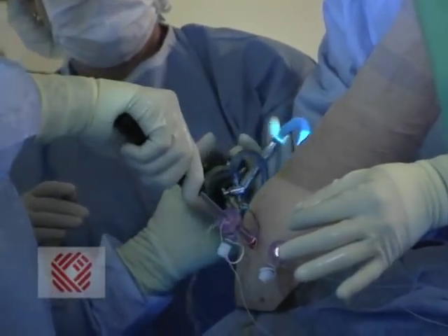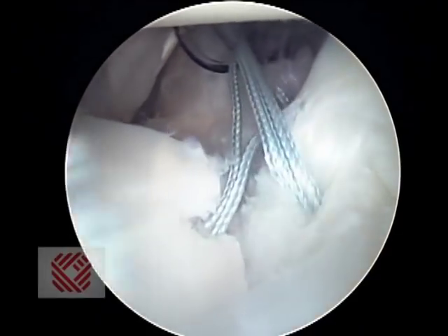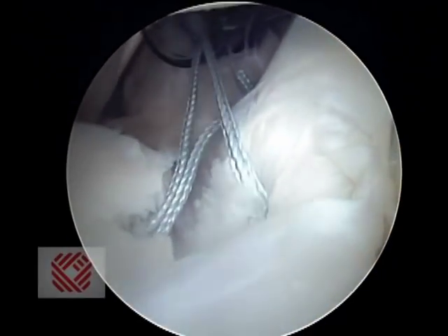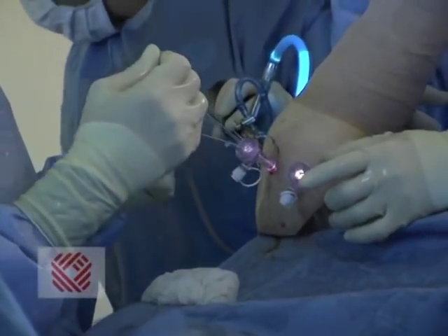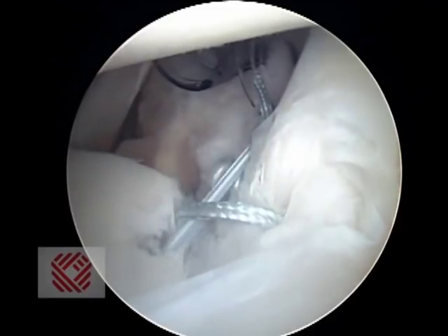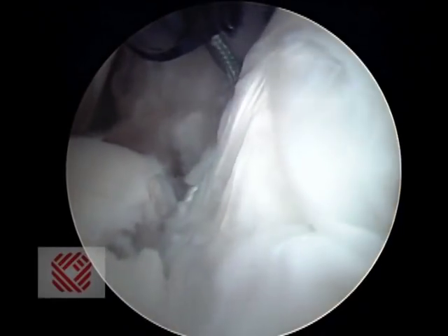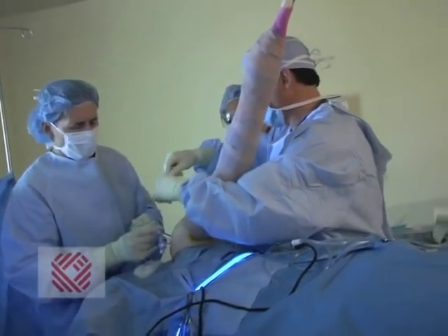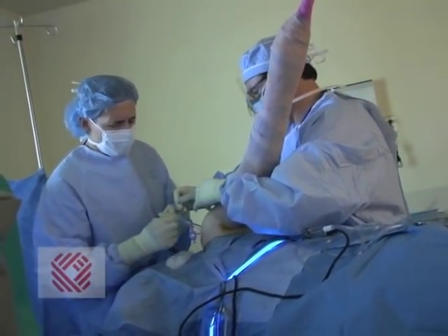We'll immobilize him in a sling for six weeks, but he'll start some therapy and gentle motion. If you have symptoms where you feel like your shoulder is unstable — getting out, catching, locking, changing positions, or a giving-away sensation — that usually means you're having shoulder instability. You should be seen by an orthopedic surgeon who uses arthroscopic technique to stabilize the shoulder. We're going to tie this suture knot down, and that should complete his repair.